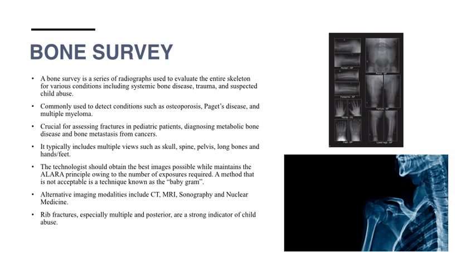A bone survey is a series of radiographs used to evaluate the entire skeleton for various conditions, including systemic bone disease, trauma, and suspected child abuse. Commonly used to detect conditions such as osteoporosis, Paget's disease, and multiple myeloma. Crucial for assessing fractures in pediatric patients, diagnosing metabolic bone disease, and bone metastasis from cancers.